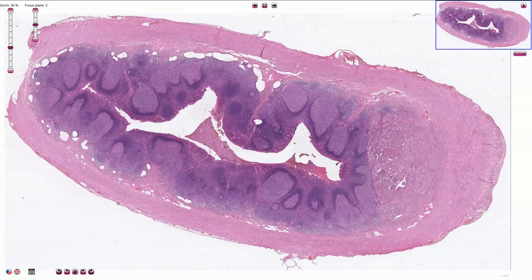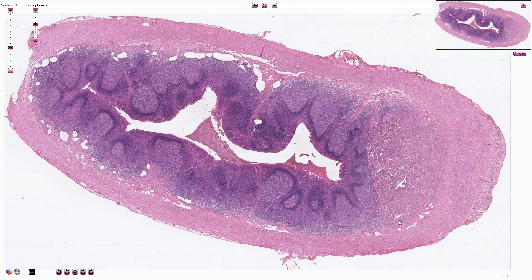Here we can see the appendix affected by neuroendocrine tumor. The typical localization for neuroendocrine tumor of the appendix is the tip of the appendix, and we can see the tumor here.